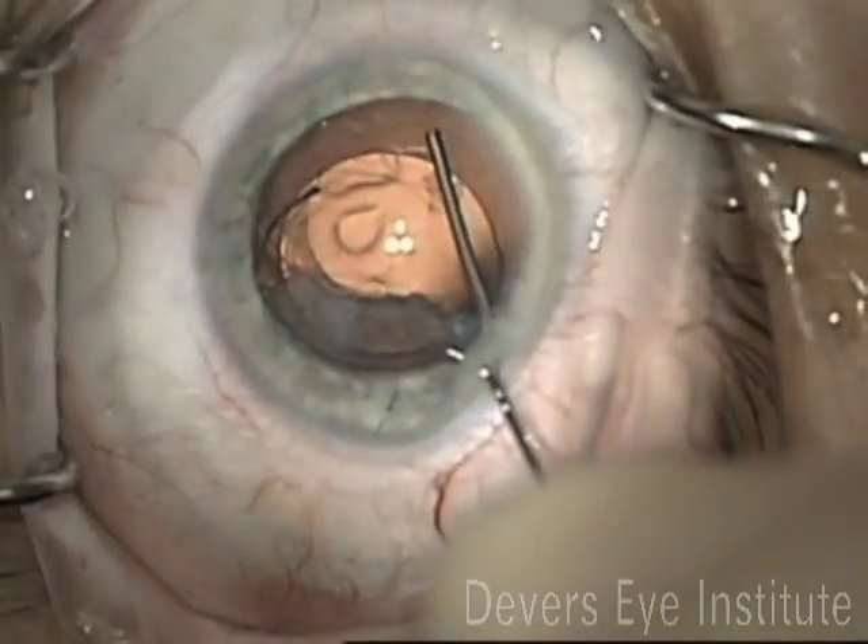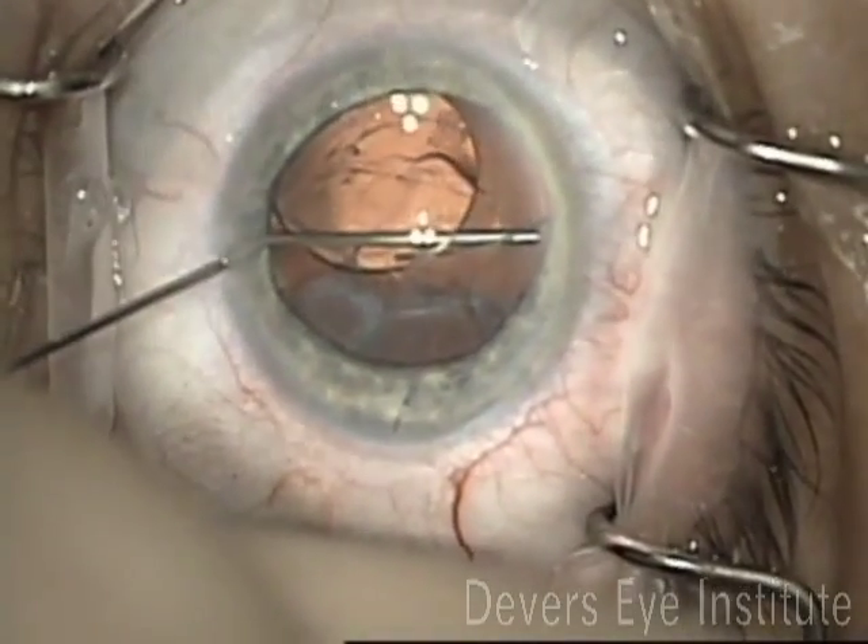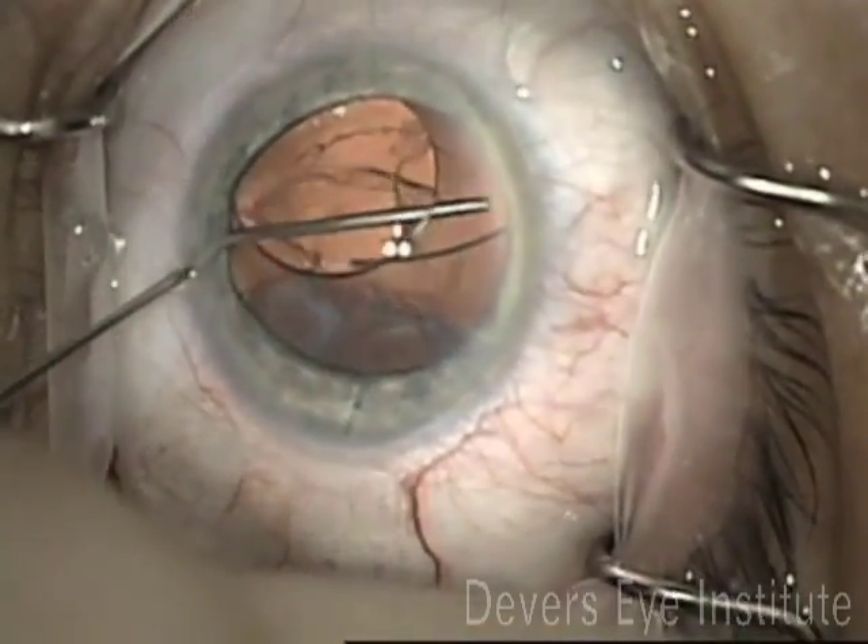Next, I dissected the capsular leaflets apart using viscoelastic to free up the optic and to make sure that both of the haptics were in the sulcus.